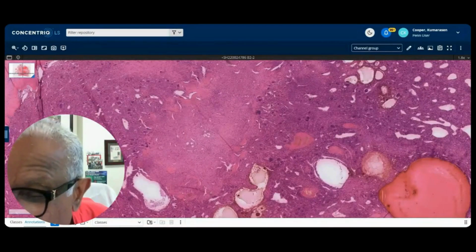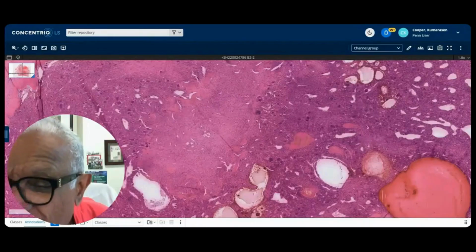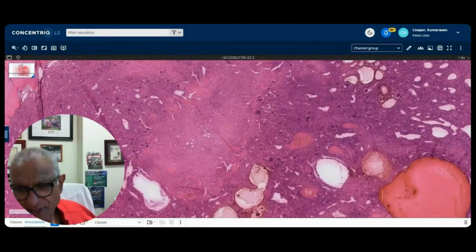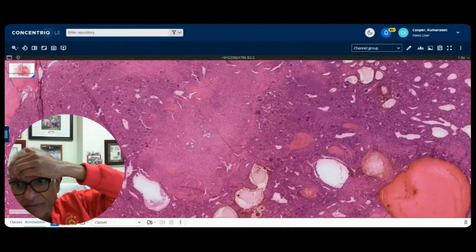Bone, you pointed out, looks like, yes, it does look like woven bone. That's correct. Other tumors that are rearranged, anybody with USP6? Just give you a chance to type in the differentials, because it's useful to know what other tumors are USP6 rearranged. And if there are any residents or registrars, these are board type questions that can be asked as well.